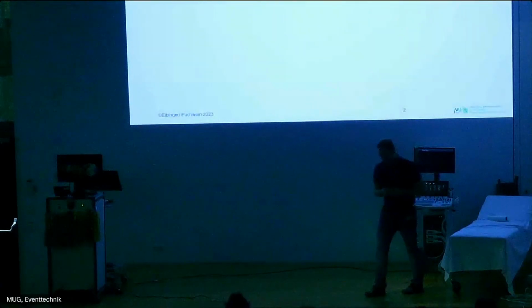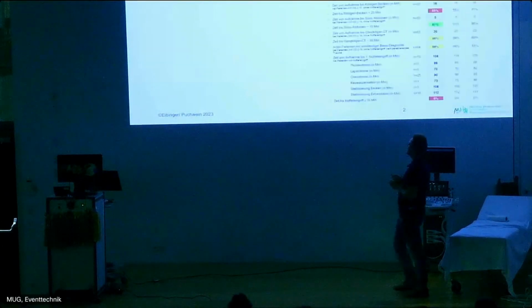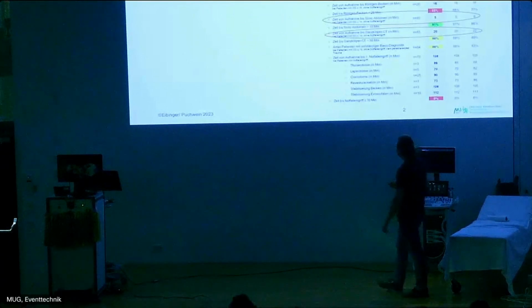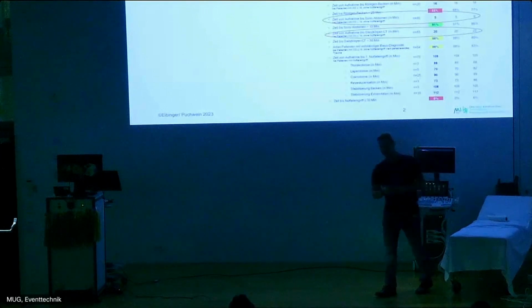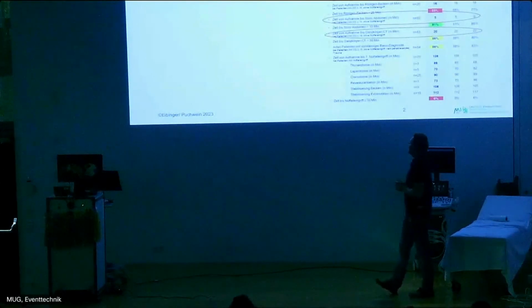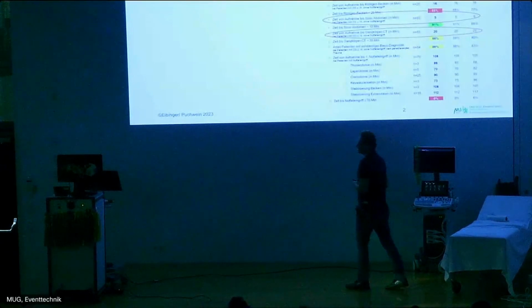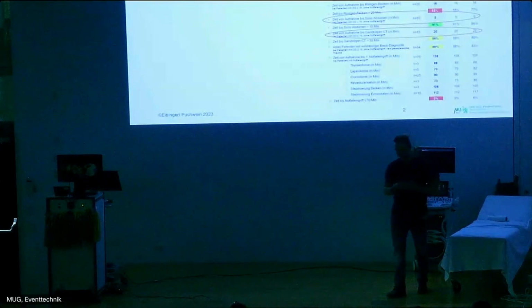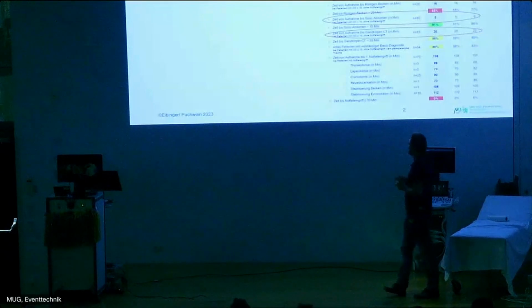Yes. So why do we need the eFAST protocol? If you take a look at this slide, you see if we compare the time from the eFAST to the CT scan, we lose around 15 minutes from the start of the examination, and you don't have to forget that the CT scan at least needs another 10 minutes. So we are going to lose probably 25 minutes from the diagnosis.